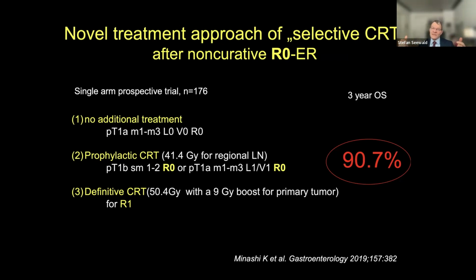And sometimes it's better to wait how everything develops in the one or in the other direction, and then to decide for an endoscopic resection or not. So a follow-up of 6 to 12 months in such a situation is acceptable. I would not perform an ablation of these areas. This, I think, we have to mention very clearly. So in such a case, it is better to follow up the patient than to do anything. And I think you will not miss anything in the follow-up, but it is important that the patient will come to you for the follow-up.